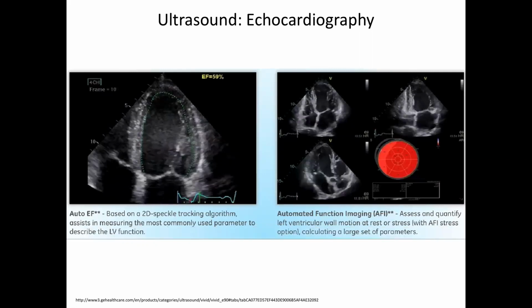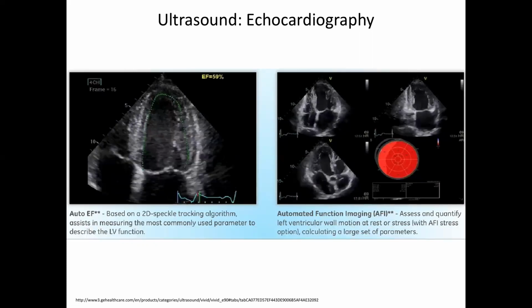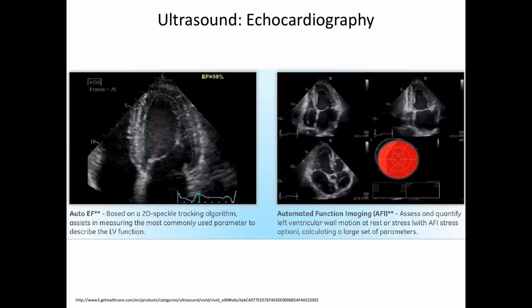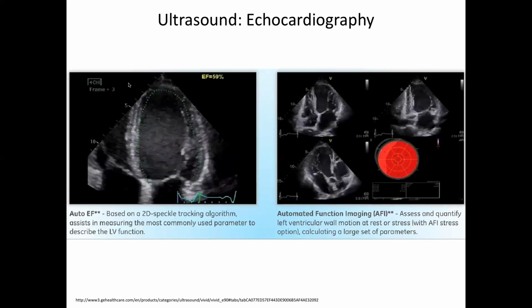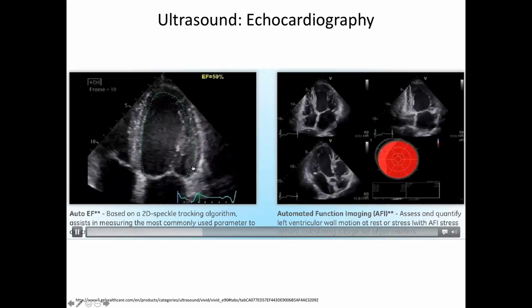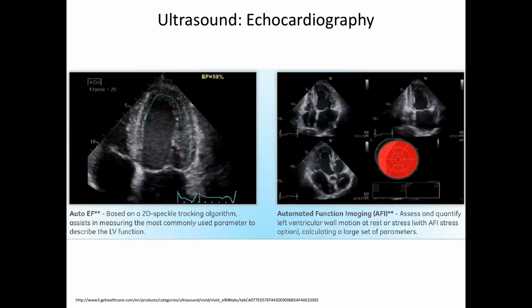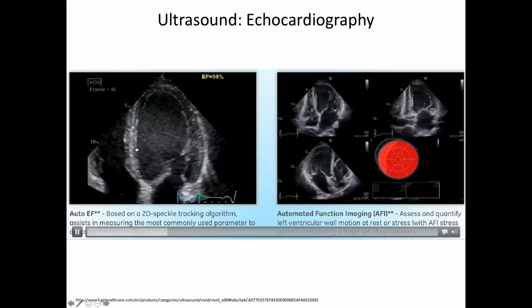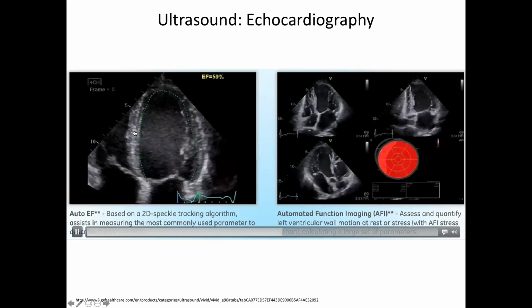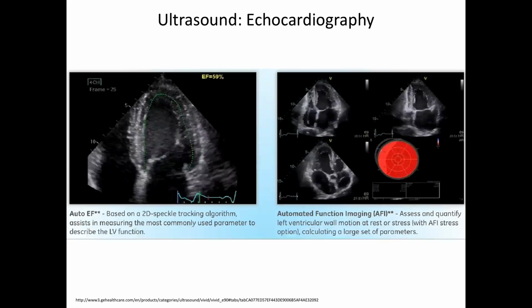And so here, what's often done to try and get an objective measurement of what the ventricular performance is, you'll draw these contours. So this is a contour line that has been drawn at each time frame with the guidance of a human. Okay, so the human draws these contours. As we saw in segmentation with the CT, we can have an algorithm running underneath that says, well, I'm not going to go past this because there's a signal barrier here and I'll stop the contour from growing that way.